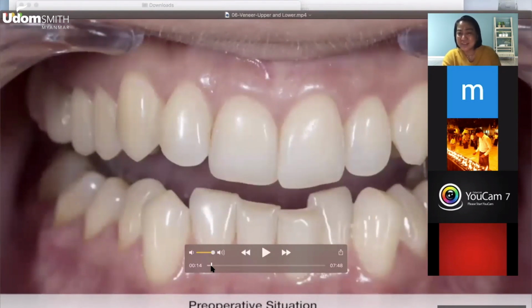Another thing I like about Edelweiss is that it is very easy to polish and finish. You do not need a special polisher and finisher like zirconium. And if it breaks, then you can repair it with composite because it is very compatible with composite, because its original raw material is composite, even though it became vitrified glass. Okay? However, if you repair it with composite, always remember that that composite will stain. The Edelweiss will not stain, but the composite that is exposed or that you used for repair will stain, because that's composite. Edelweiss is already vitrified glass.